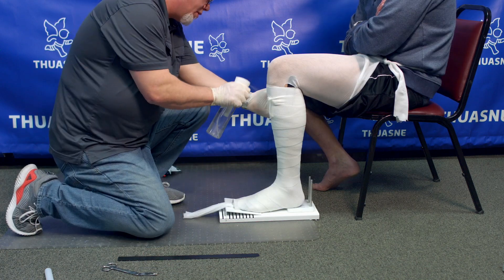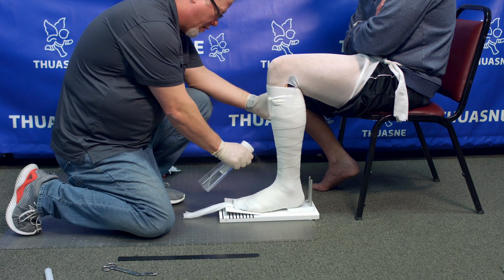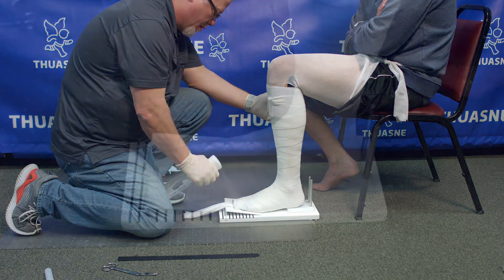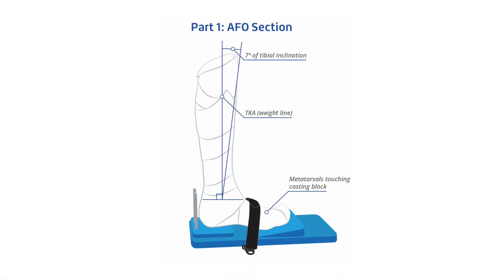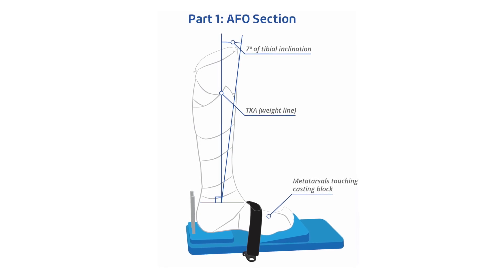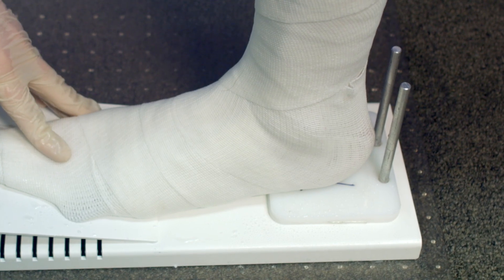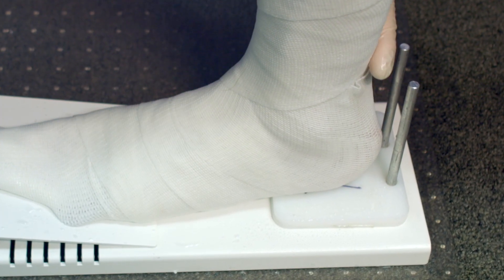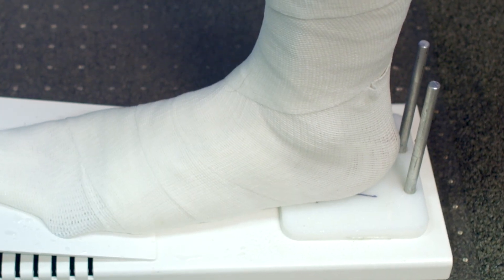Once you have finished applying the fiberglass, start generously spraying the entire surface of the cast with a water spray bottle. Place the patient in the correct position: metatarsal touching the casting block, 7 degrees of tibial inclination, neutral sagittal and coronal alignment. You can use the poles of the casting block as a reference for correct position, but be sure the heel does not touch the poles of the casting block.